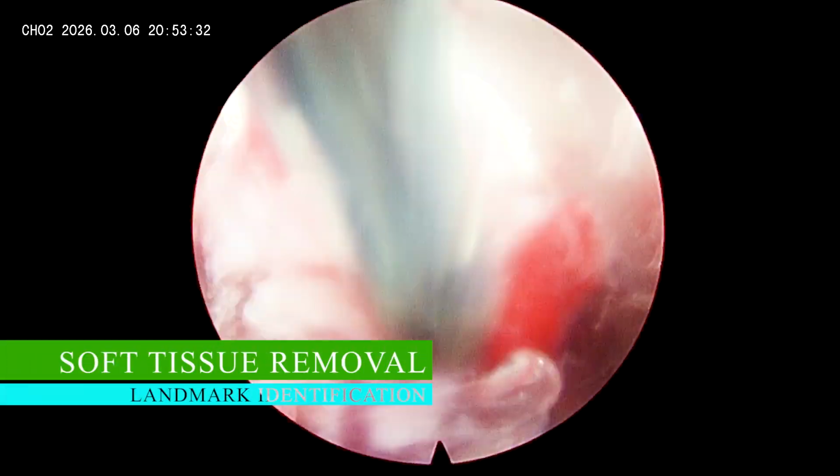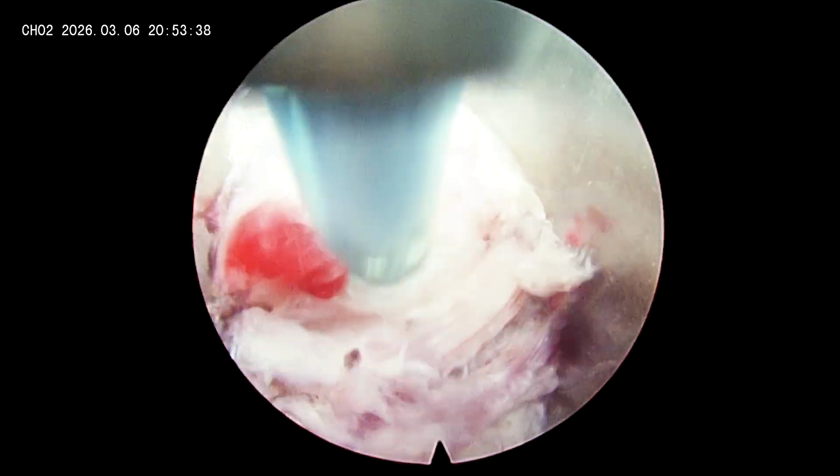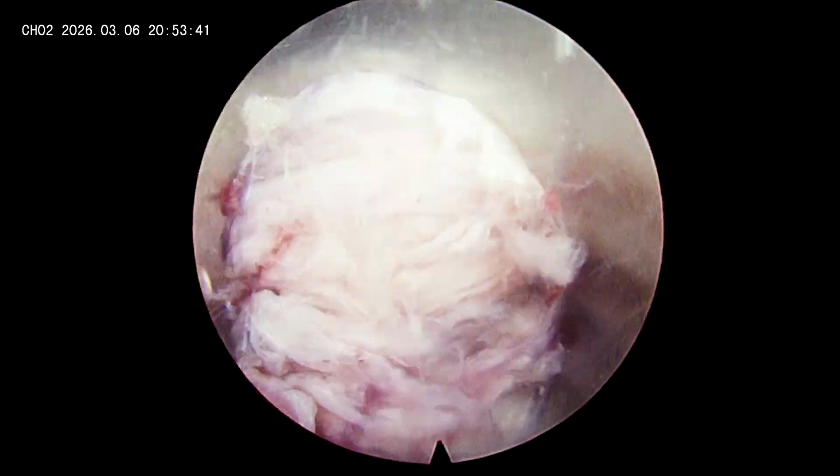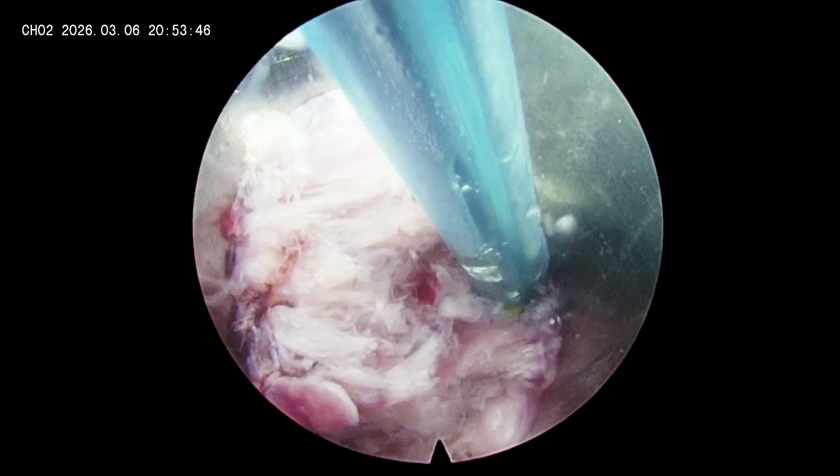The moment you are inside, you can see there is blood and soft tissue lying in front of you. The first step is to coagulate all the bleeding vessels with the help of a radiofrequency ablator, and then you can remove the soft tissues in the interlaminar window. Remember, in this case we are not going to do any bony decompression. It is very important to coagulate all the bleeding vessels before plucking the soft tissues. Here I am coagulating with the help of RF, which is a 4 MHz radiofrequency ablator.